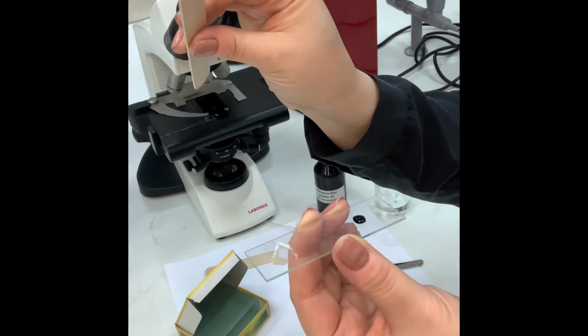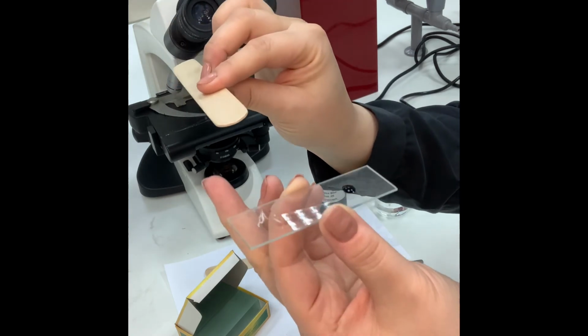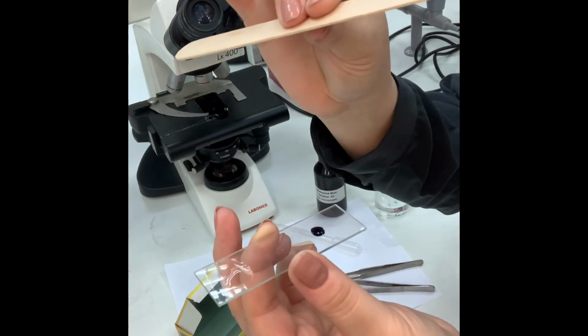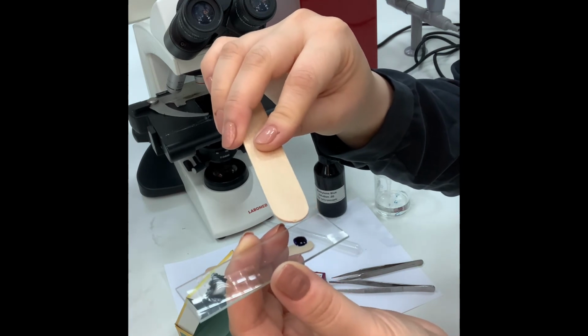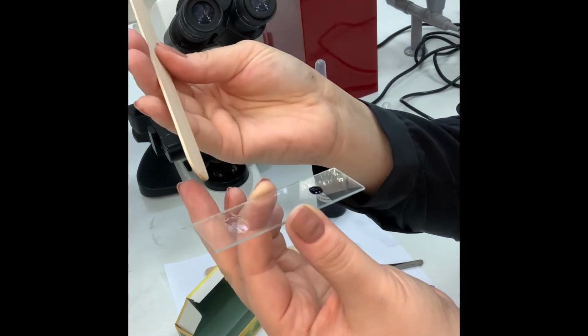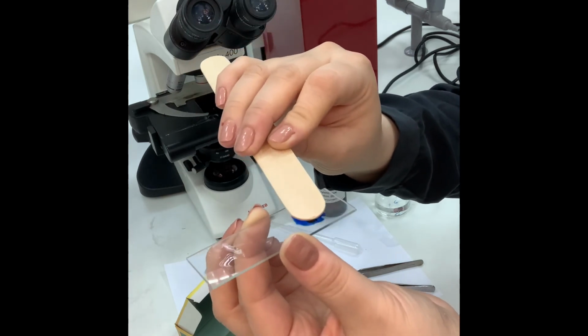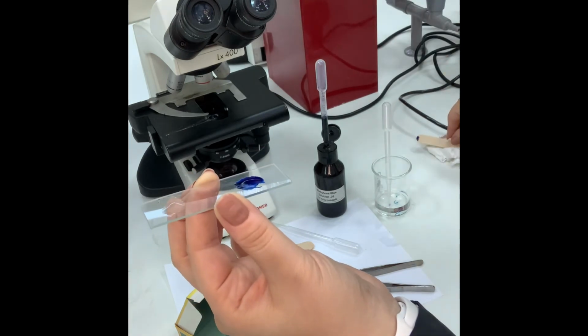And I will take another side of the wooden stick or use another wooden stick to collect another sample for the drop of stain. I won't use the same spot over here. I will change and give it a little bit of mix. Once I'm done, I will get rid of it.